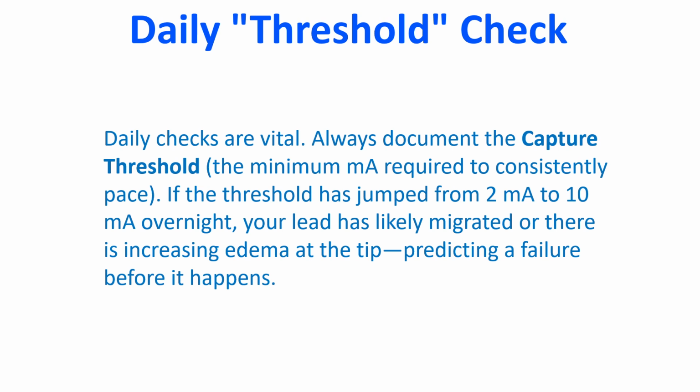Always document the capture threshold, that is, the minimum milliamperes required to consistently pace. If the threshold has jumped from 2 milliamperes to 10 milliamperes overnight, your lead has likely migrated or there is increasing edema at the tip, predicting a failure before it happens.